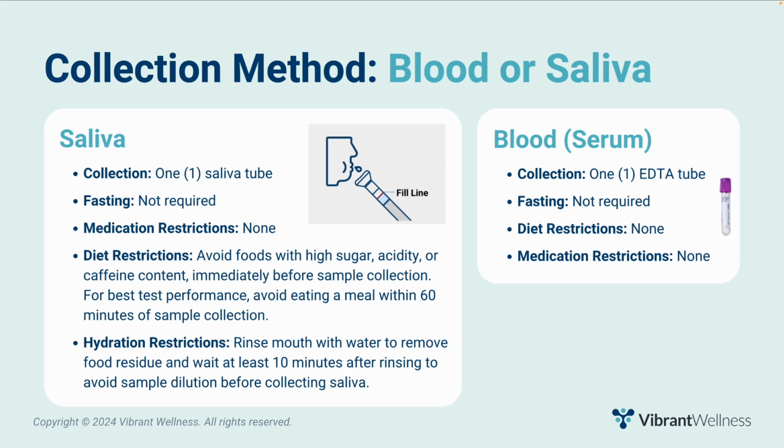However, patients should avoid foods high in sugar or acidity or high caffeine content immediately before sample collection. And for best test performance, avoid eating a meal within 60 minutes of sample collection. Additionally, patients are instructed to rinse their mouth with water to remove food residue and wait at least 10 minutes after rinsing to avoid sample dilution before collecting saliva.